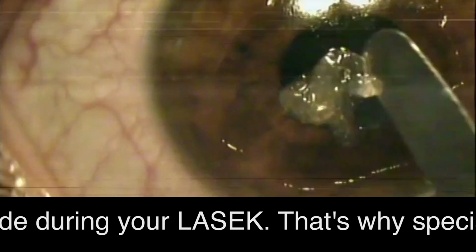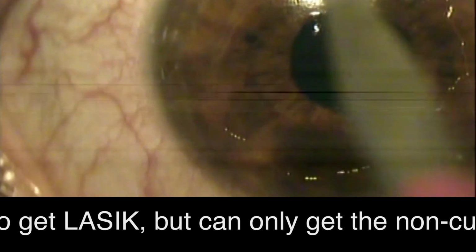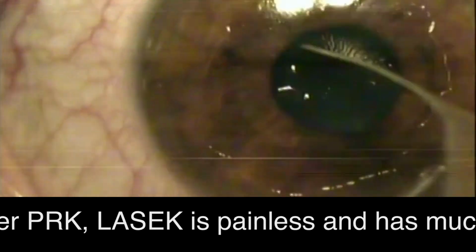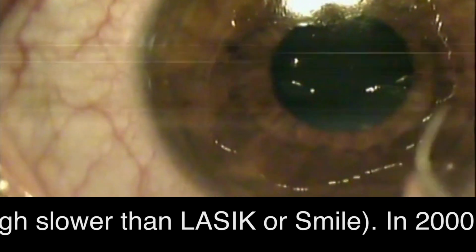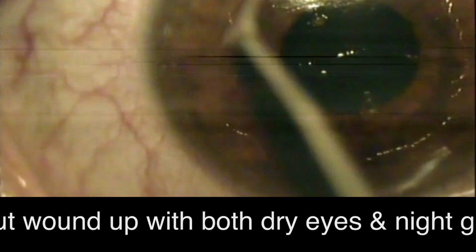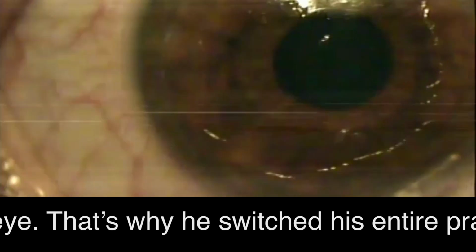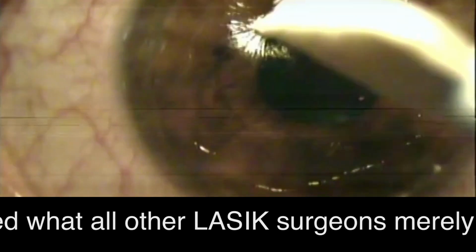You can also see that the skin of the eye is coming out. It's coming off really easily, and it's because the alcohol solution delaminates the epithelium, which is just a fancy way of saying it separates the epithelium from the underlying corneal stroma. And we have to do this because otherwise when you laser, some of the laser energy is going to be wasted vaporizing and evaporating the skin of the eye, which would just grow back, so you wouldn't get the full prescription removed. So now you can see there's little pieces of epithelium, so I'm just using a Weck-Cel sponge.